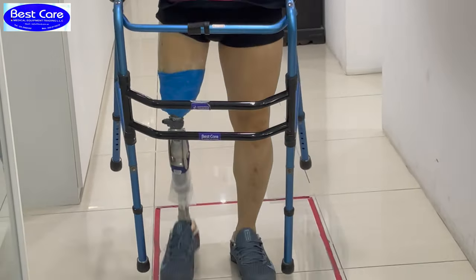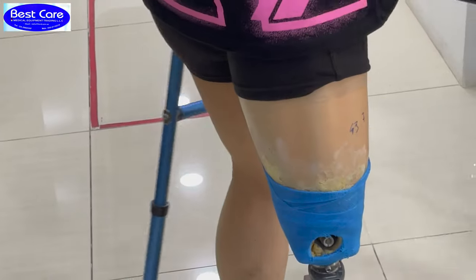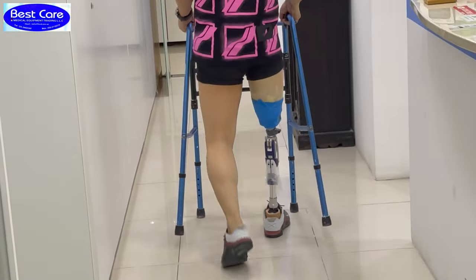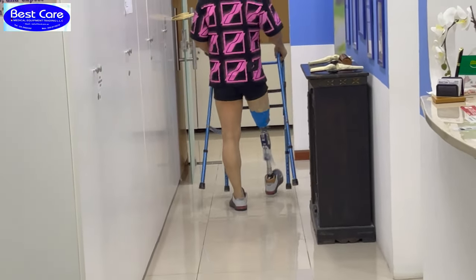For the trial, we are always giving between 3 to 5 days, according to the fitting and the comfort level of the patient. He can decide when he is willing to stop the trial and go for the final lamination.